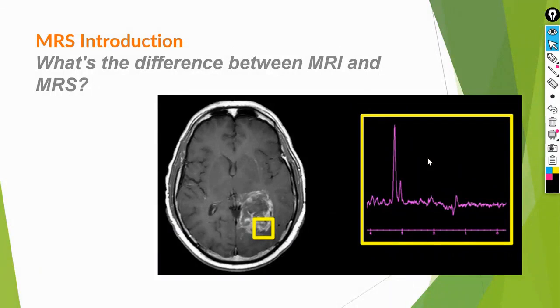If I can determine the concentration of the metabolites present in my pathology, it gives me an indication of the type of problem. Additionally, if I am monitoring the situation and it worsens, knowing what is happening inside is very important.